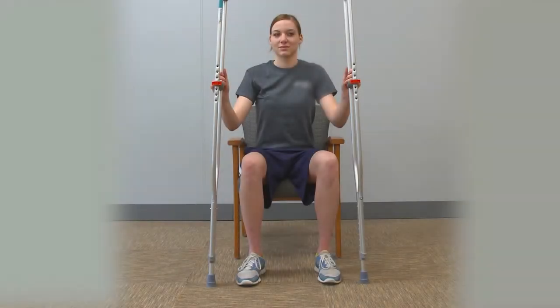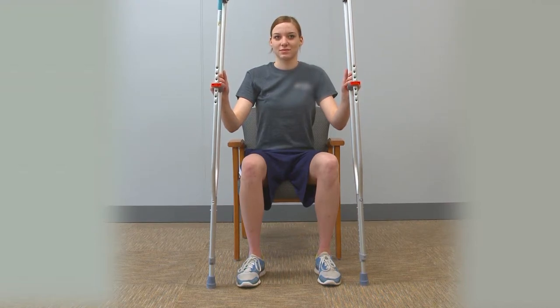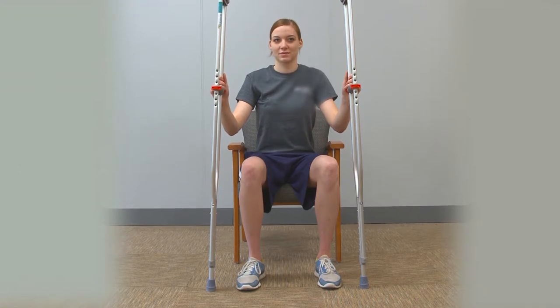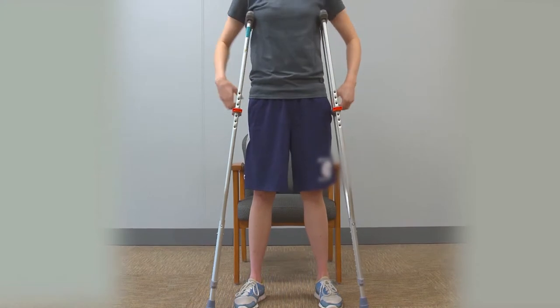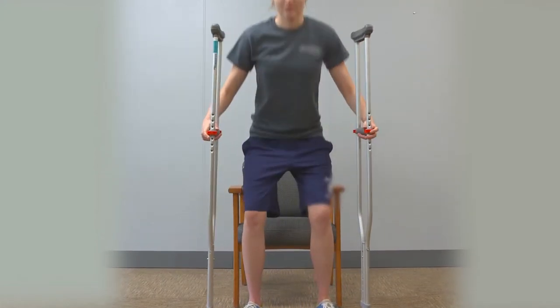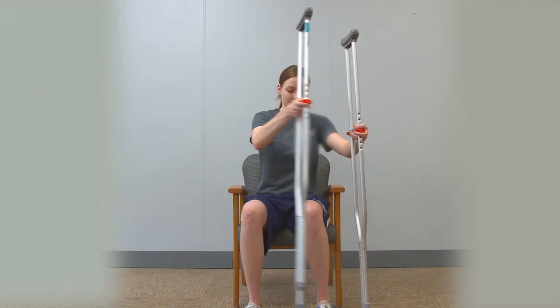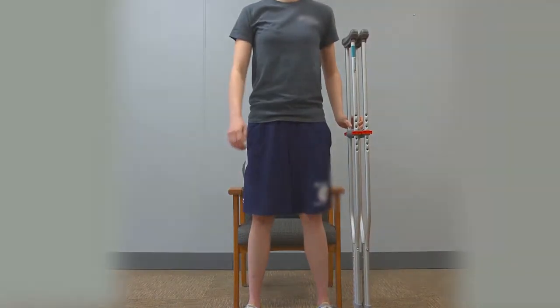When rising from a chair with 50% weight-bearing, both feet can be on the ground with equal weight through them. Keep feet and knees shoulder-width apart for better stability and use of your buttocks. Place crutches in each hand and have them in the ready position when you stand. Tighten your abdominals and buttocks and while maintaining an upright posture, rise up from the chair. If you don't feel comfortable with crutches in each hand, you may put crutches in one hand and use the armrest from the chair to help you stand up.